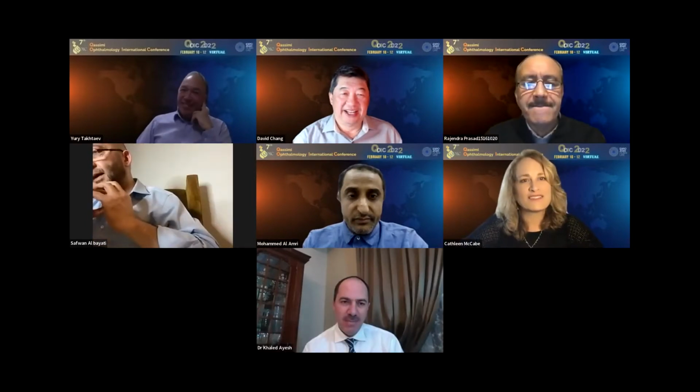I also wanted to say that sometimes it's nice to do the optic capture before the phaco too. It just provides a little bit better plug there to any further vitreous coming forward. But I think that's an excellent technique. And it really does save you having to wait till things fall in the back and make a more difficult situation for your retina colleagues. And then I guess the other point is just to be sure that a very thorough peripheral retinal exam is done. Yeah, no, that's all. I thought it was a very elegantly done case, and just those 2 points.